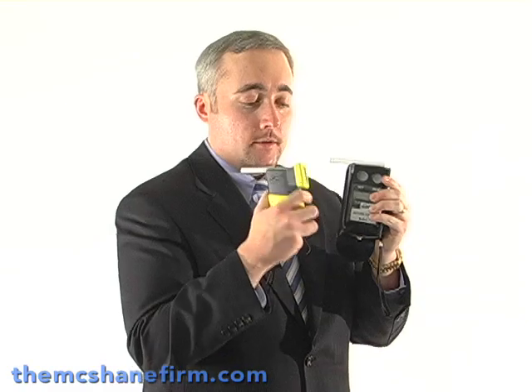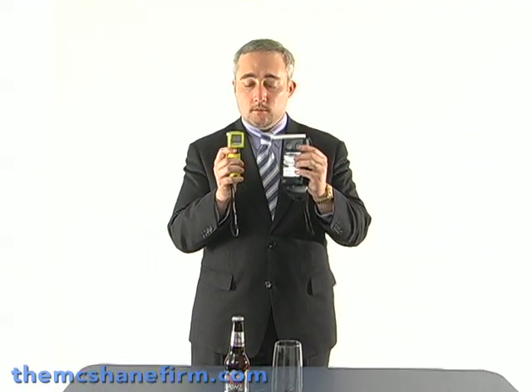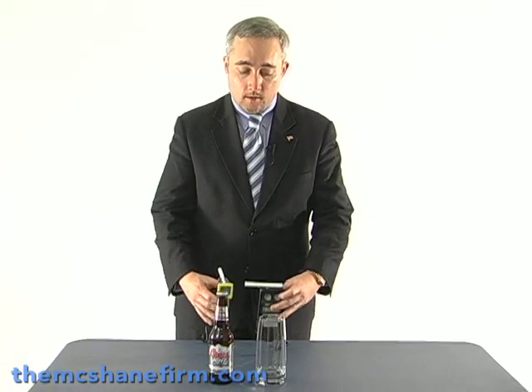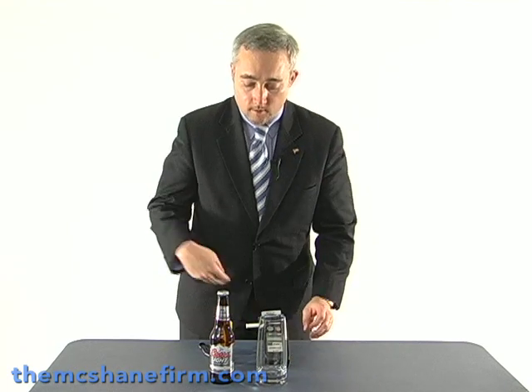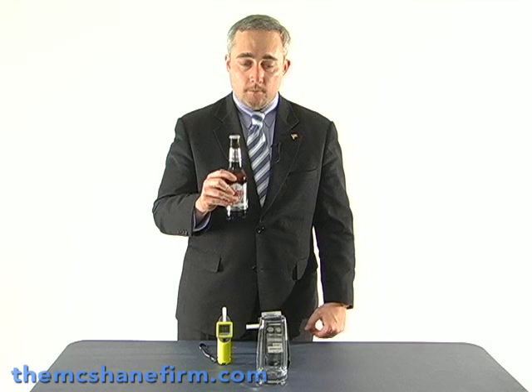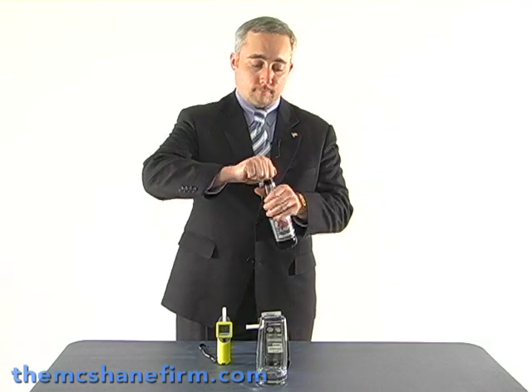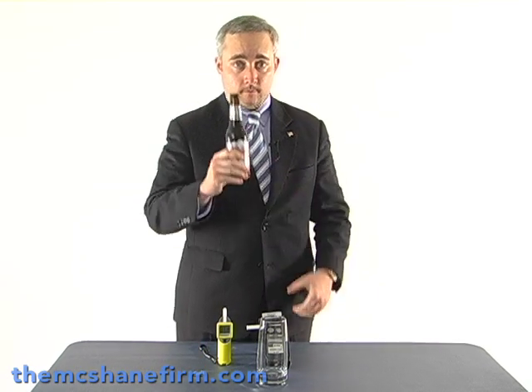So again, we're going to set it and we have the yellow one — we're going to turn it on and put it down here. What we're going to do next is take a garden-variety Coors Light beer, open it up, and I'm just going to swish it around in my mouth. Not going to drink it — but here's to you.